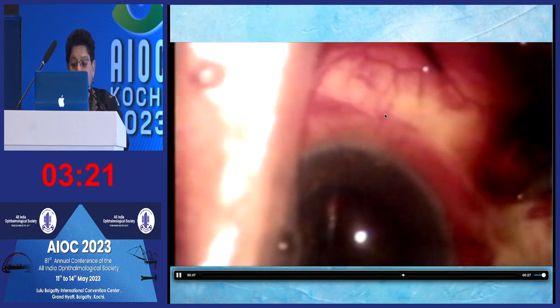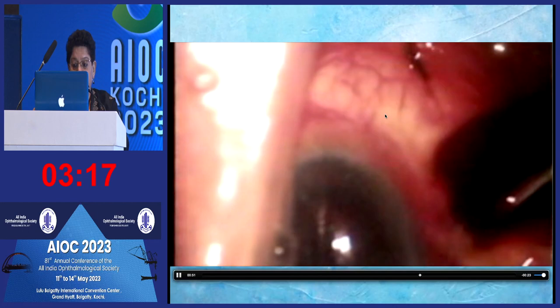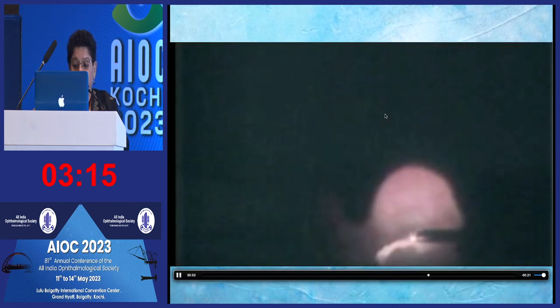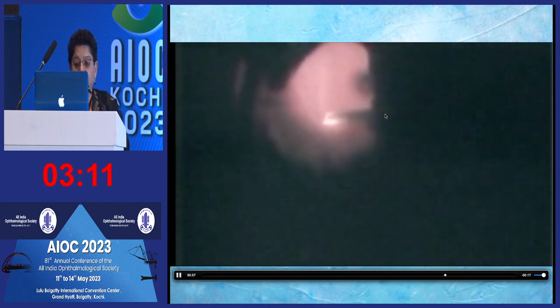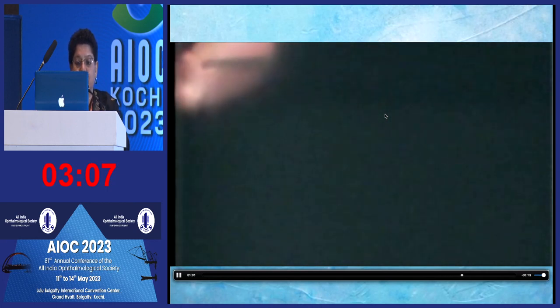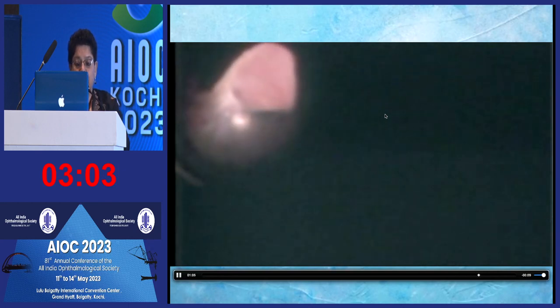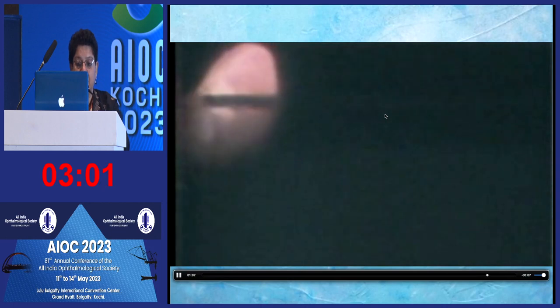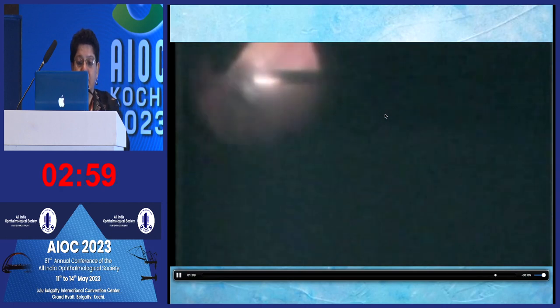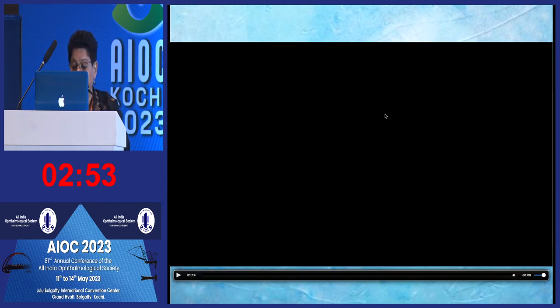The eye was closed, and 15 days later, this eye was taken for a release of blood. You see the dark fluid which is coming out, dark blood. And when you go inside, there are a lot of membranes which have formed inside the eye. You clear it up effectively, the retina is in its place, and you can give a successful endpoint to a rather gruesome looking surgery.